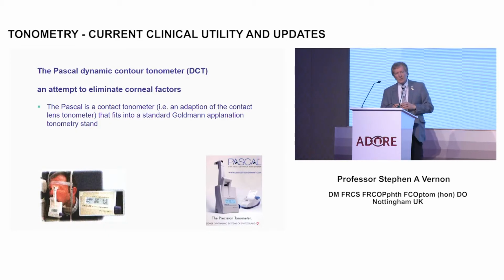So the Pascal dynamic contour tonometer is an attempt to eliminate these corneal factors because it works in a different way.